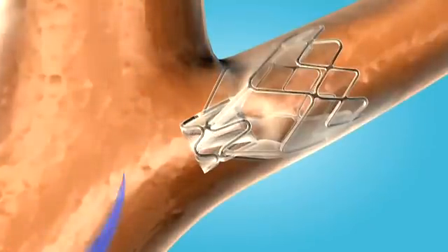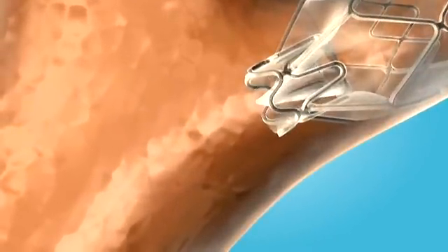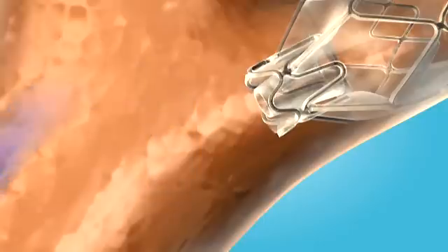The one-way valve is designed to prevent air from entering the most diseased portions of the lung, while allowing trapped air and fluid to escape.